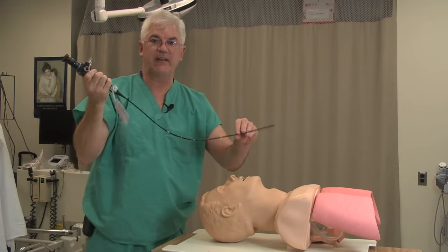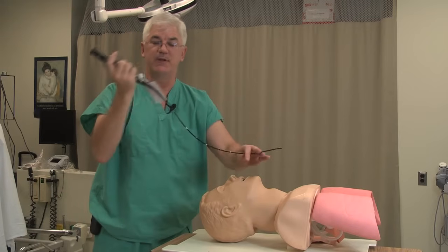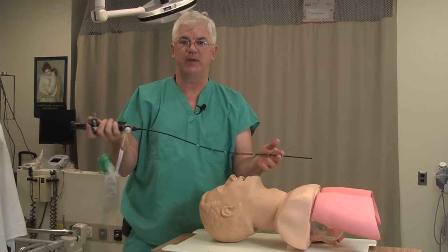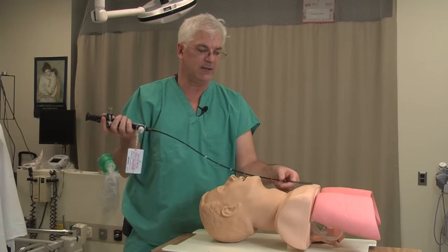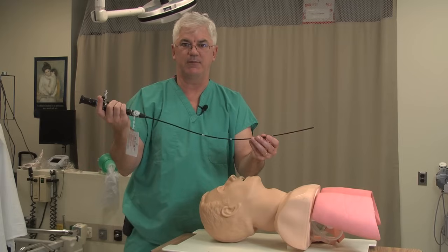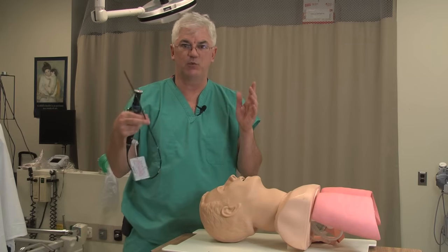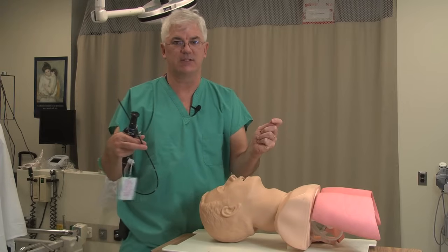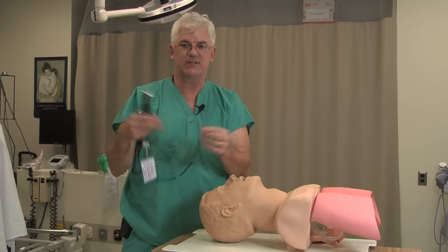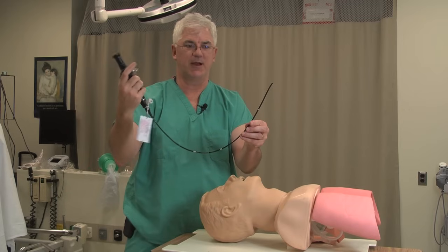I'll show you a few tricks I found very handy for placing an endotracheal tube. When would you want to use a fiber optic? Any time you anticipate a difficult intubation — if by history or physical exam the person is difficult to intubate and direct laryngoscopy simply will not work. Many people solve this with a GlideScope, but the GlideScope won't always get it for you, whereas the fiber optic just about always will. So you want to have a lot of facility in doing a fiber optic intubation.